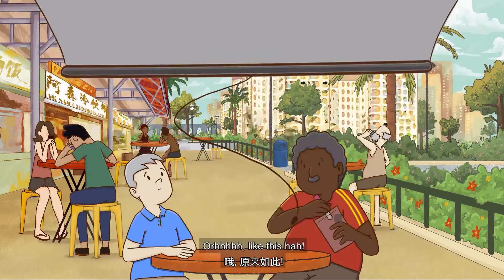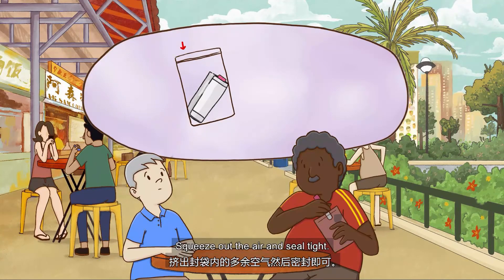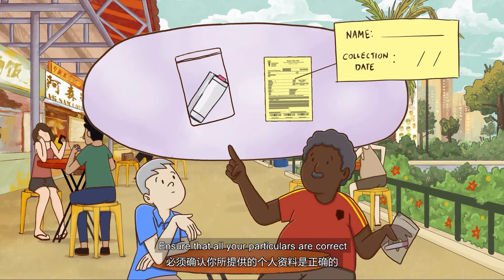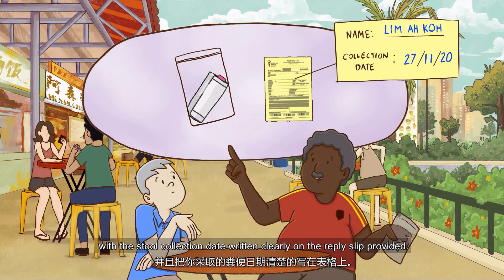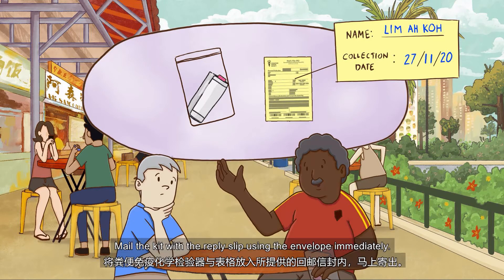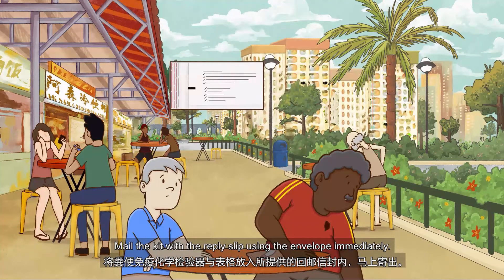Wrap the Fit Kit with the absorbent paper and put it into the ziplock bag. Squeeze out the air and seal tight. Ensure that all your particulars are correct with the stool collection date written clearly on the reply sleeve provided. Mail the kit with the reply sleeve using the envelope immediately.